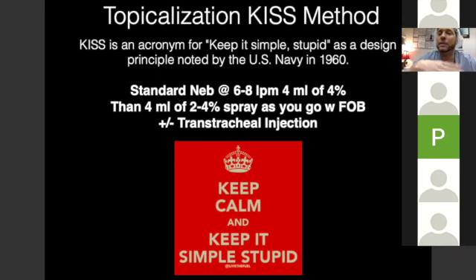They've inhaled it. Some of it got to the proximal trachea. But still, before I go through the cords, I want to give them a spray. So I have that syringe on there. I go in the mouth, I see the cords, and I empty my syringe.